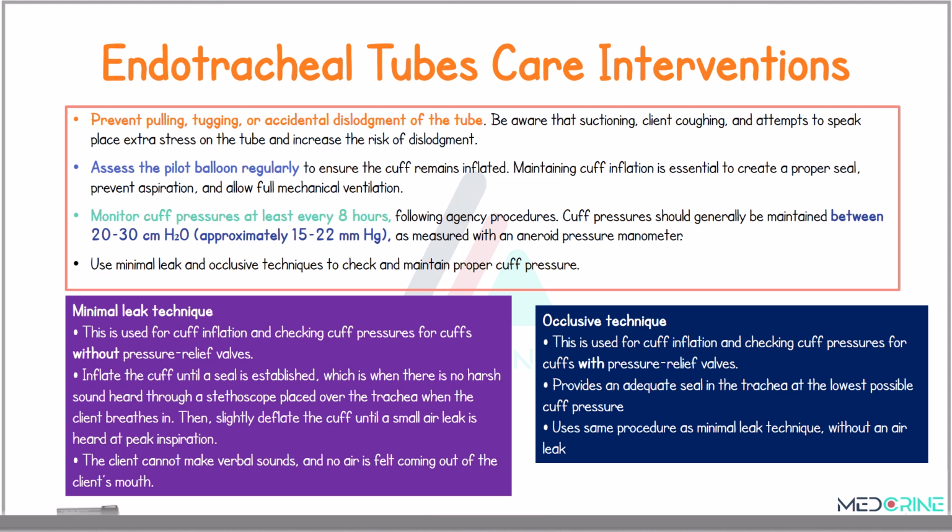of dislodgement. You need to assess the pilot balloon regularly to ensure that the cuff remains inflated. And we maintain cuff inflation to create a proper seal, preventing aspiration and allowing full mechanical ventilation.